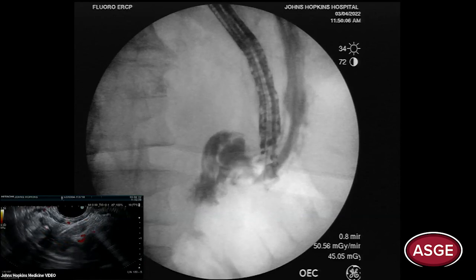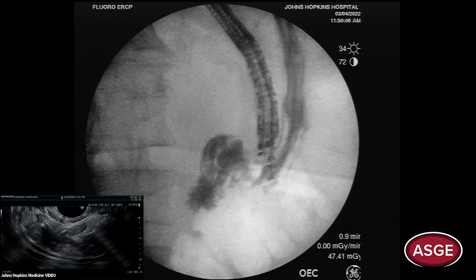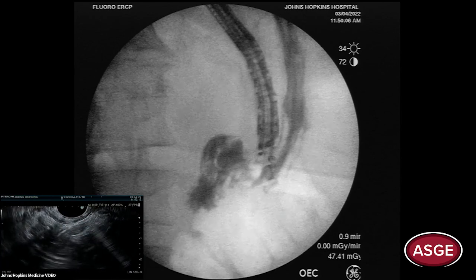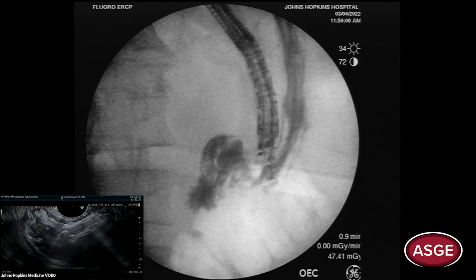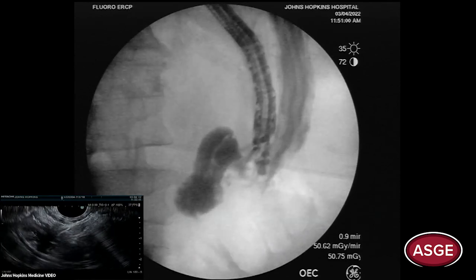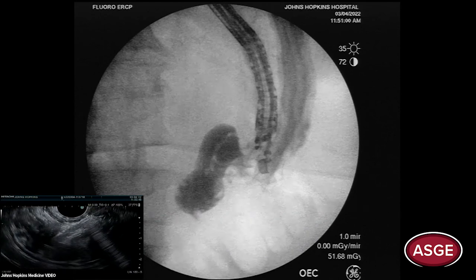Good — let's get the pump going. When you see the sand dollar sign it really means you're probably in the mid-body of the stomach. Often when you end up wanting to put the AXIOS, it's more in that vertical part once you get it all filled — that's my experience — because the angle going into the stomach is not acute when you want to get the ERCP scope through.